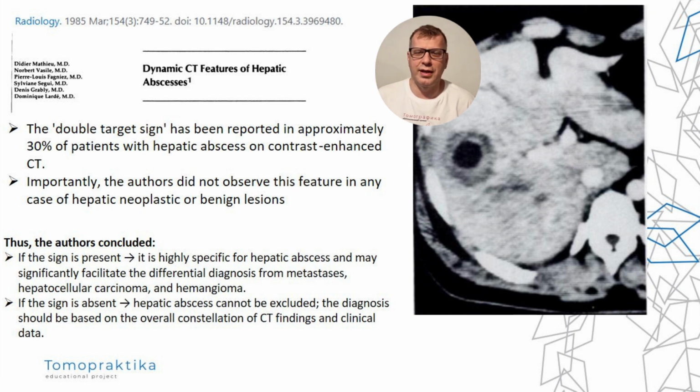This is actually a relatively young radiological sign. It was first described in 1985 in patients with liver abscesses on contrast-enhanced CT. It's not very common, seen only in about 30% of cases. But importantly, it does not occur in other hepatic lesions.